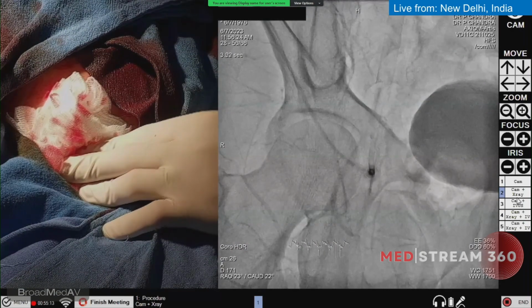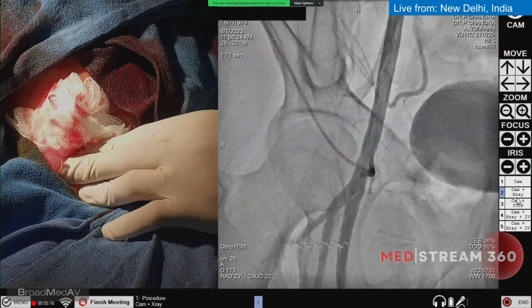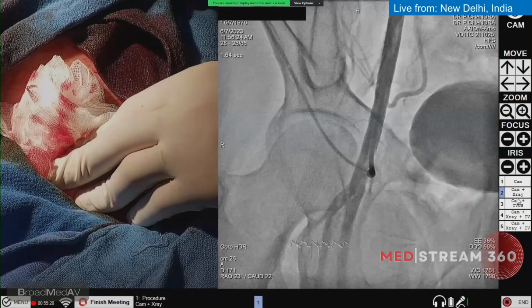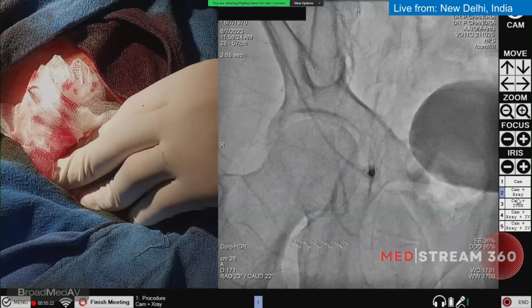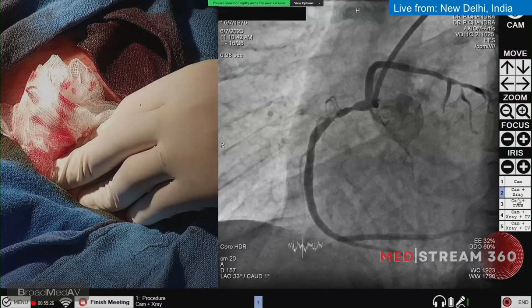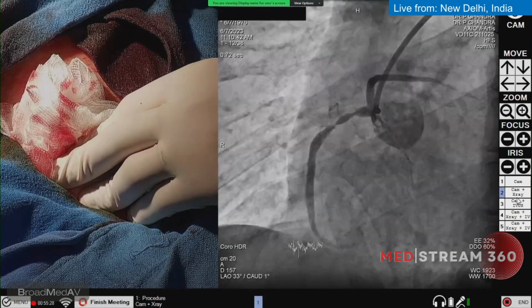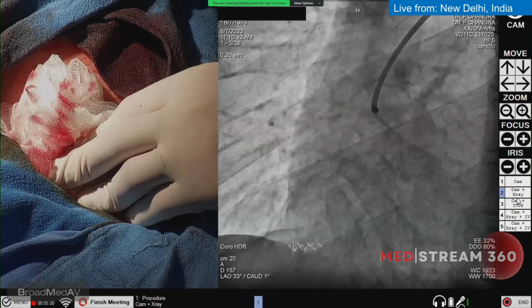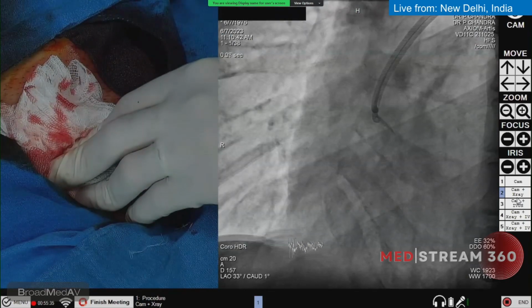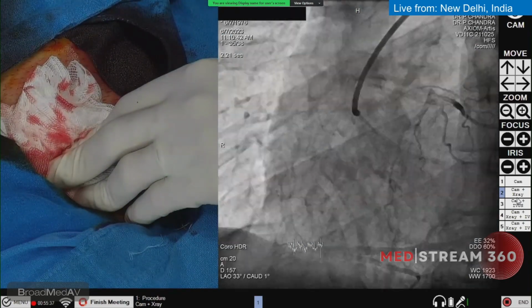We demonstrated an anomalous coronary artery, which is a left main anomalous coronary origin from the right sinus, and the lesion was at the bifurcation, which we treated with a drug-eluting balloon and a cutting balloon without any dissection, no residual. And the right coronary, which was the dominant vessel, was simply treated with a 4.5 size stent because IVUS imaging showed it is a 4.5 vessel.